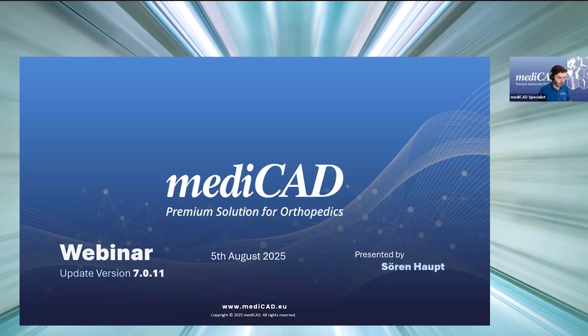I will quickly go over what we are doing today. Obviously, we're going to review the next mediCAD update 7.0.11. First, I will explain a little bit about the general strategy and goals of this update. Also highlight a few major topics in this update, and then we'll go into the actual application, of course, and go through a few modules to show the new features that are in this version. So yeah, let's move on.